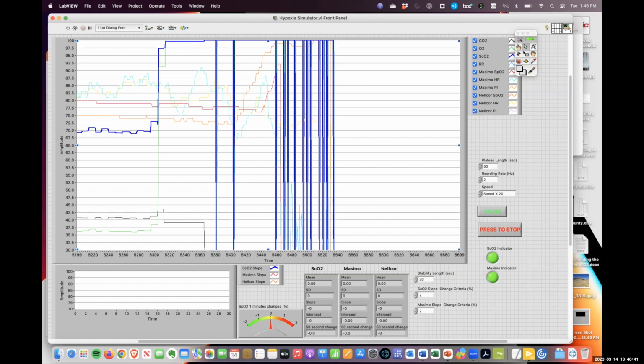I don't think it represents lung water or anything, but it can be an issue. Both the stability and some gas exchange changes down in the 70s are very, very noticeable, and will always result in probably worse data at the lower saturations, more noise, independent of whether the pulse oximeter is actually performing well. The pulse oximeter probably doesn't perform as well in those areas either. They all have a sweet spot, which is probably why the FDA definitely wants nice even data over the ranges. Hopefully this gives you a flavor of the challenges of this and the noise.